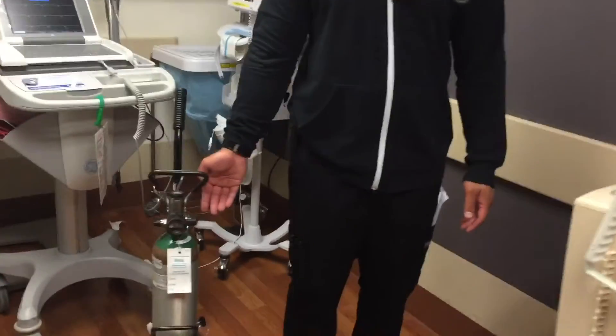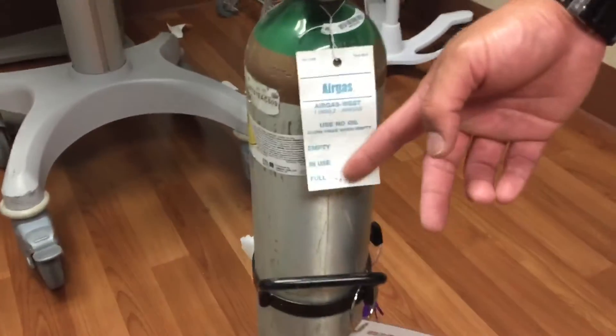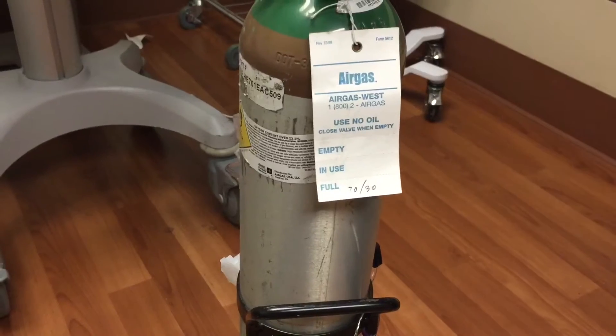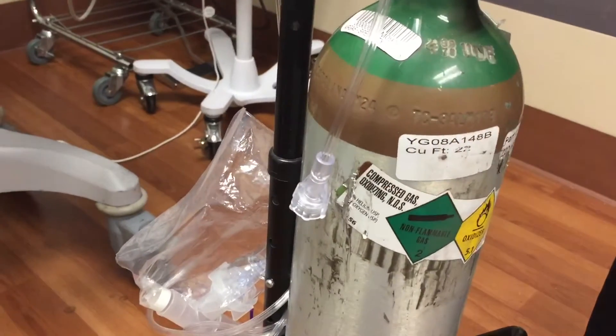This is an E-cylinder and here on this tag you'll see the helium to O2 blend. We have a 70-30 mixture — that's 70% helium, 30% oxygen. You can also find the mixture on this sticker here which will say 70-30. We also hold E-cylinders that consist of an 80-20 blend — that's 80% helium, 20% oxygen — and we also have that in an E-cylinder.